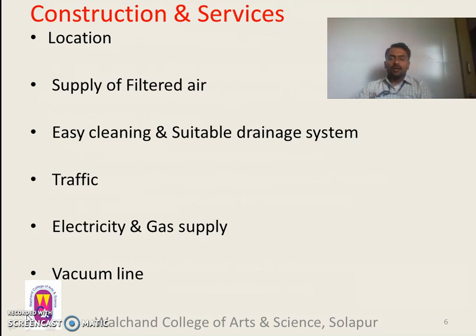The cleaning of glassware, plasticware and instruments is carried out on a routine basis in an animal tissue culture laboratory, so that the cleaning area is easily maintained within the laboratory, and whatever dirt and waste material is produced after the animal tissue culture is easily drained out from the laboratory, so that it cannot affect the health of the worker as well as the normal growth and development of the animal cells.